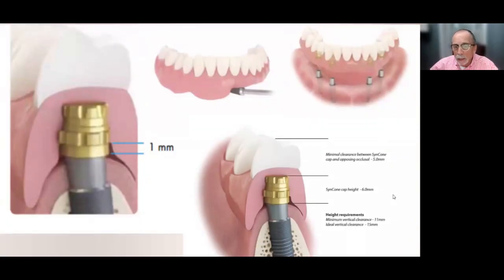And so there's what I call the magic millimeter. That's basically where all the retention happens. Everything else is very light retention, but most of the business happens in that magic millimeter. So in order for that magic millimeter retentive element to work properly, you have to have the space for it, right? So you notice the space between that millimeter and the acrylic. If you don't have that space, by a mistake in the pickup, then it can't swedge out. So you're not going to have it.